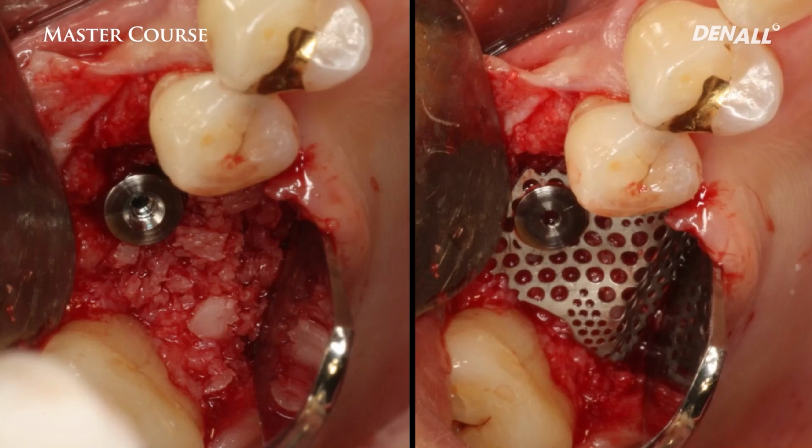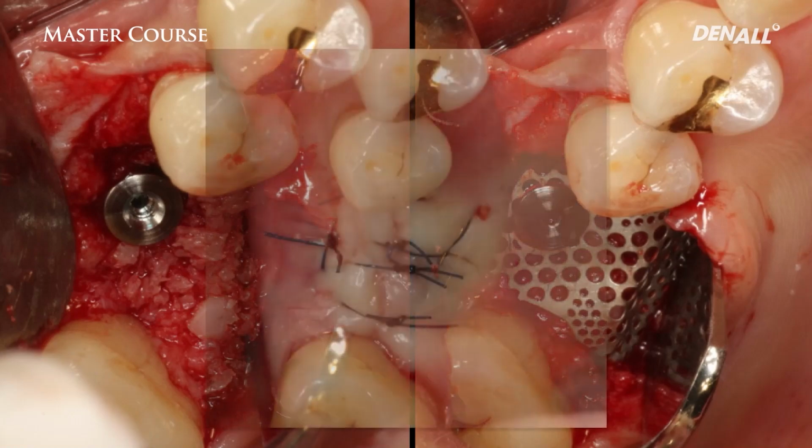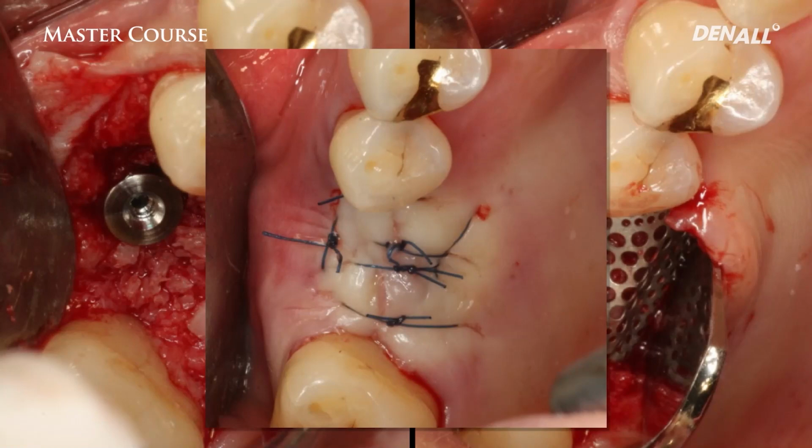Cover cap was used for fixation. Primary closure was done, as mentioned earlier. Once you connect the cover cap with the internal connection type, the extruding area is only 0.3 millimeter, and therefore it is very easy to get primary closure of soft tissue and there's less possibility of exposure.